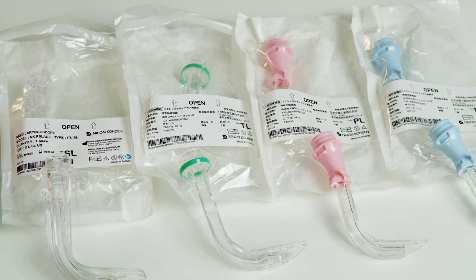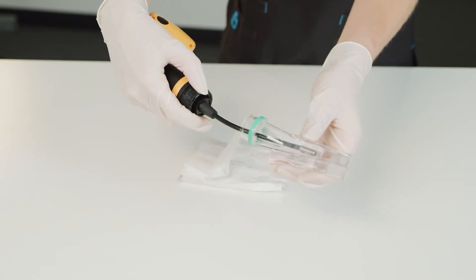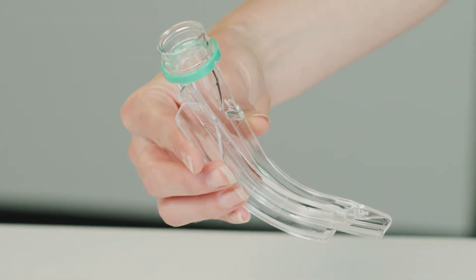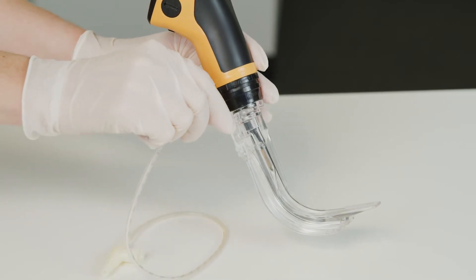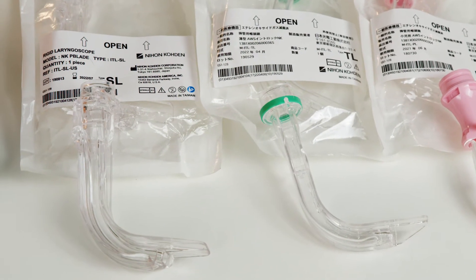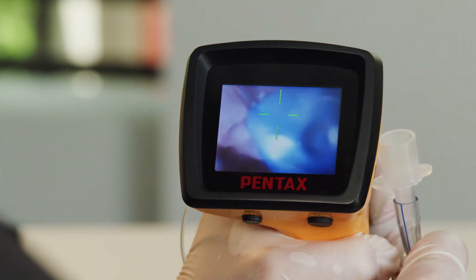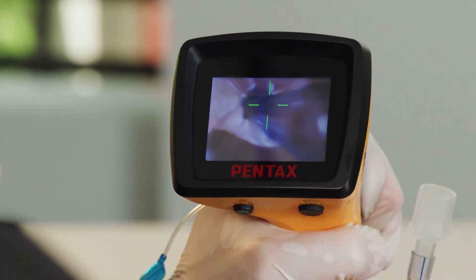The detachable NK-P blade disposable blade is sterile for single patient usage, eliminating the risk of infection. The NK-P blade has an endotracheal tube guide groove so no stylet is required. In addition, suction can be performed reliably with the ITL-SL NK-P blade and a 12 French or less suction catheter, so the clinician can easily check positioning on the monitor screen.